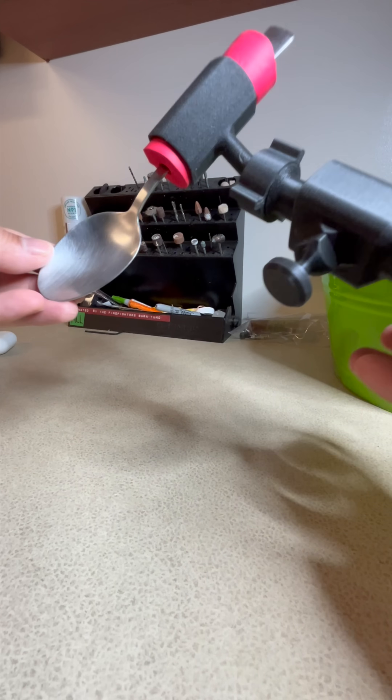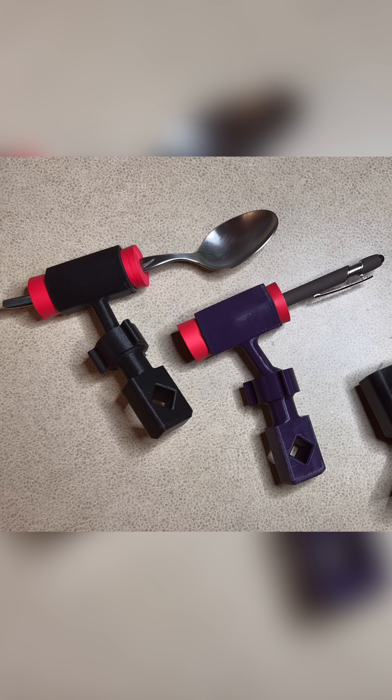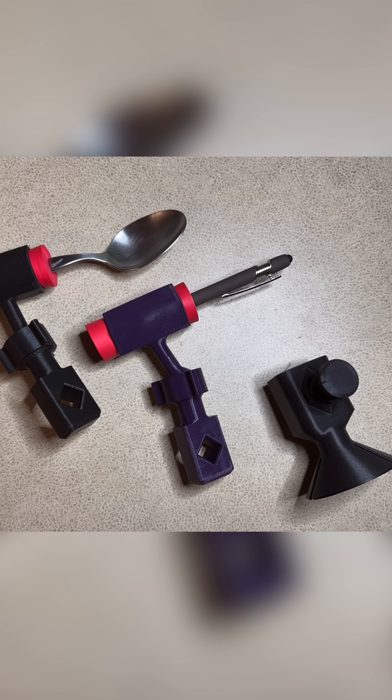This tool is for patients with new hand amputations, for light duty tasks while they're healing or waiting for a prosthetic.